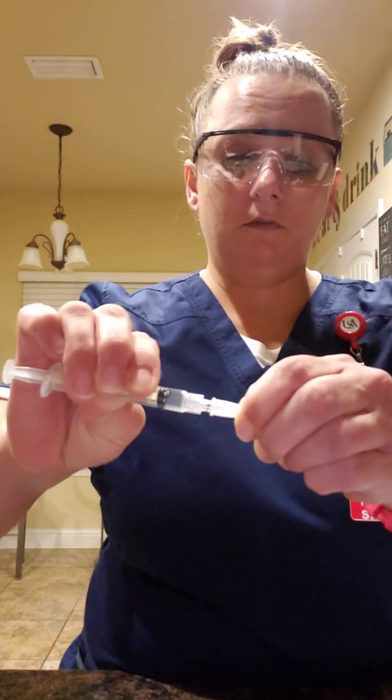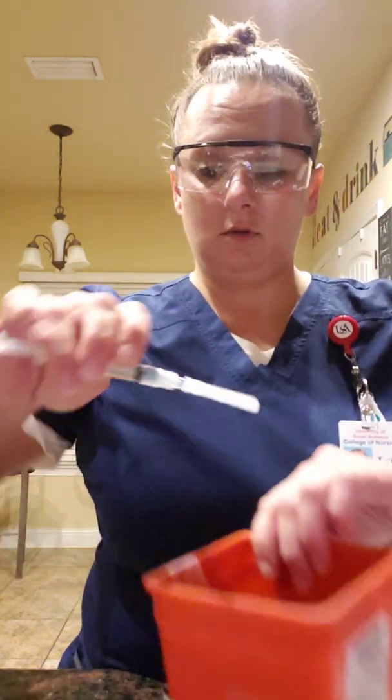Now I will recap the cannula using the scoop method. I will remove the cannula and put it in the sharps container.